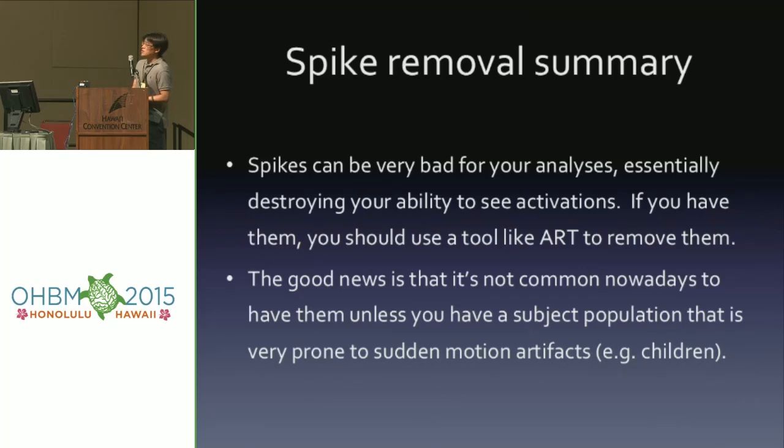Okay, so the summary for spike removal. Spikes are very harmful to data, and the good news is, nowadays spikes are not very common. However, when you study certain populations like children or, in our case, people with mental disorders, you have to be careful. In that case, spike removal might be very, very helpful to your data to achieve a certain statistical level.